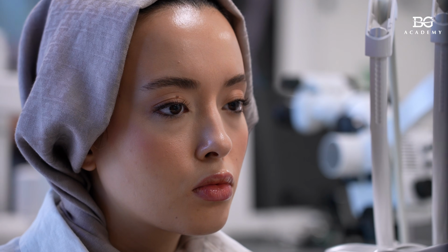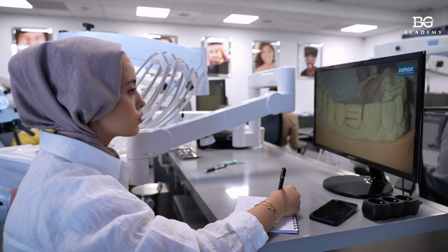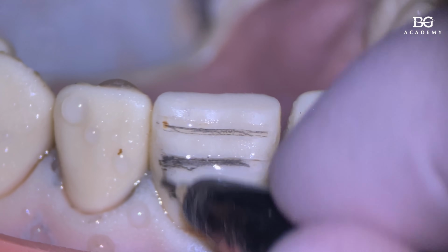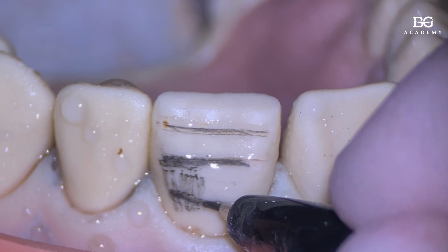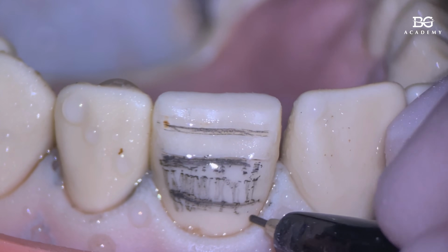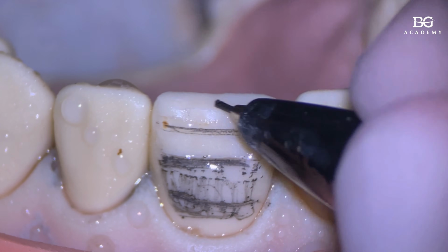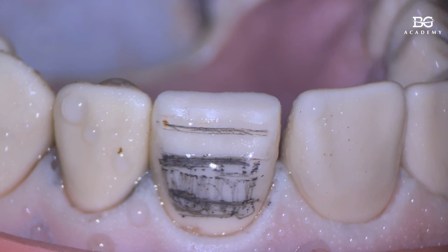I will take a pencil on the phantom. You can also do it on the patient if you want, at the beginning, just to train. I will mark with the pencil the area which I don't want to prep. So I don't want to prep here. I just want to prep here. Okay? The incisal plane is pretty long.